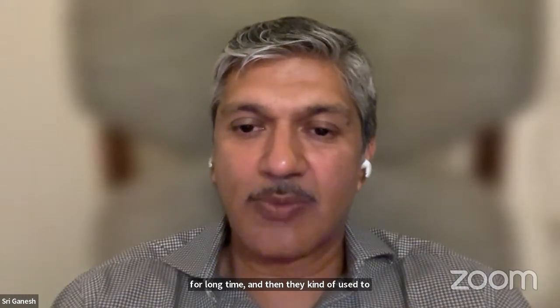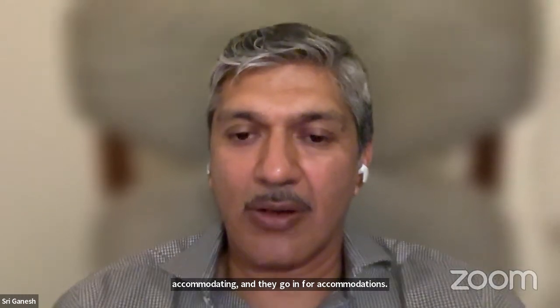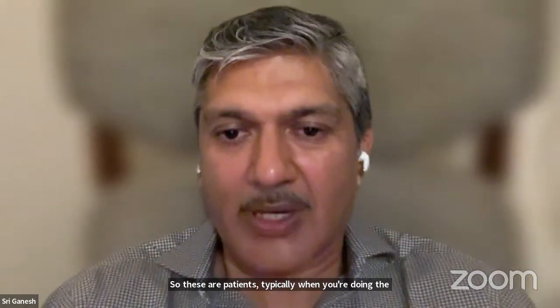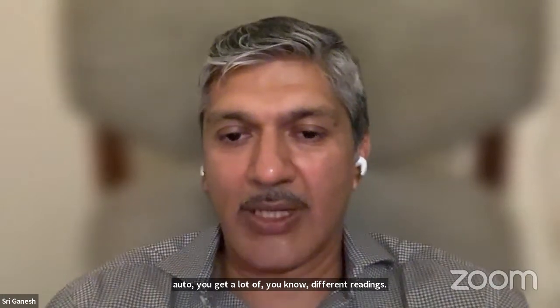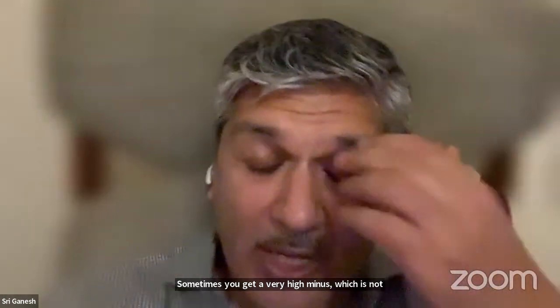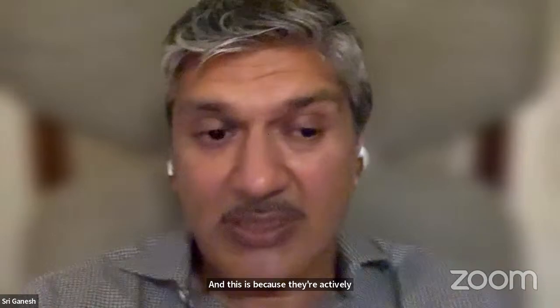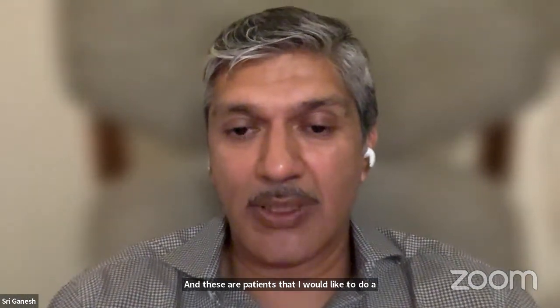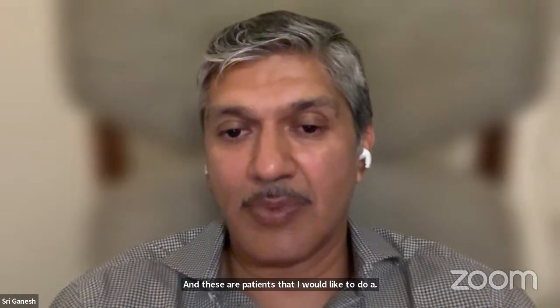So these are patients where, when you're doing the auto-ref, you get a lot of different readings. Sometimes you get a very high minus, which is not what they're wearing, because they're actively accommodating. These are patients that I would like to do a cycloplegic refraction and a PMT, or at least a dilated refraction and then a PMT.